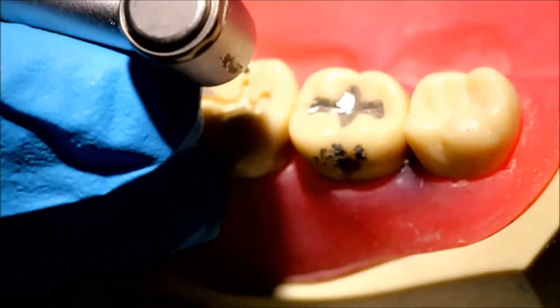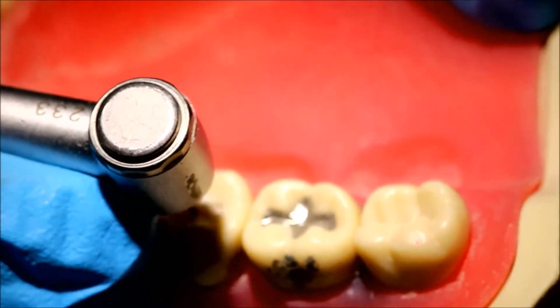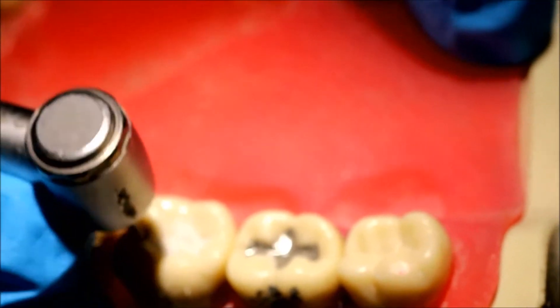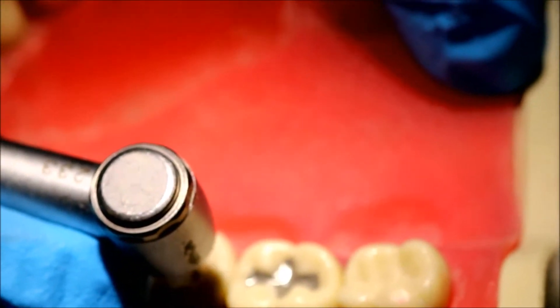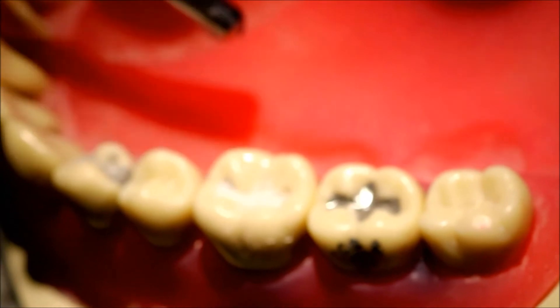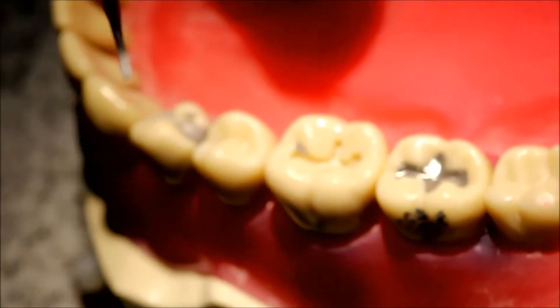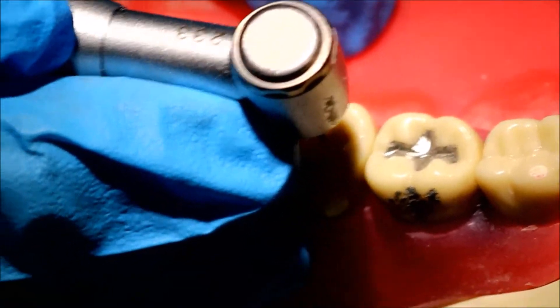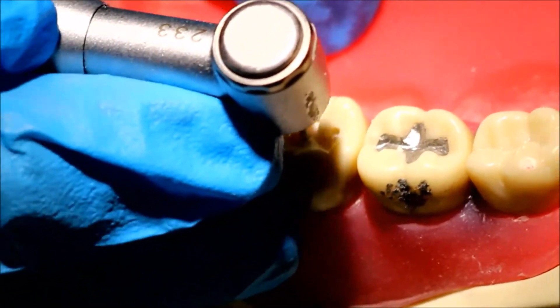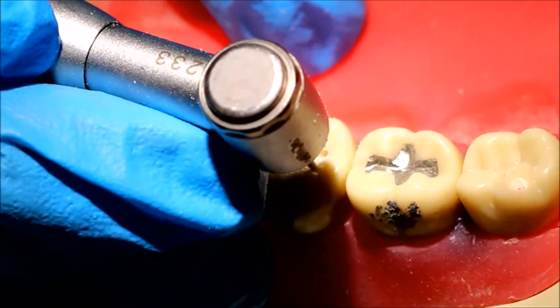At this point, take a 245 burr in your low-speed handpiece. A 245 is like a 330 but slightly longer. What you want to do is refine all of your axial walls — the axial walls are the vertical ones. I'm taking my 245 as fast as it will go in the low-speed handpiece and letting it cut against the axial walls as I trace the entire prep. Part of this will help widen the prep since I started with the narrower 329.